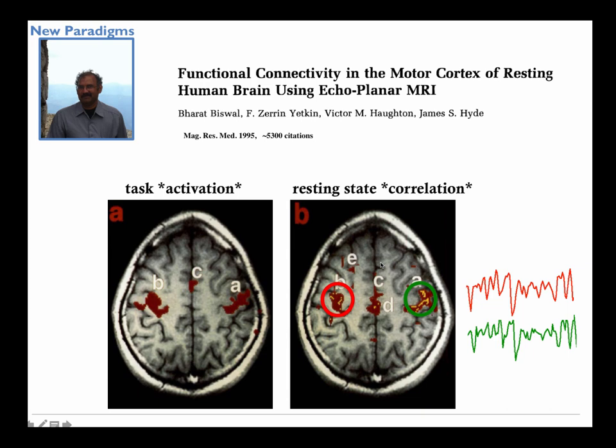What's interesting, though, is that back in 1995, when he did it, everyone was just starting their activation studies. And most scanners weren't this sensitive, and processing methods weren't really keeping up. Believe it or not, we didn't really have the ability in other packages to pick a voxel as a reference function. I know it's very easy in MATLAB or whatever now, but back then it was something odd. And so everyone ignored resting state fMRI for a decade. So nobody cared. There were maybe one or two papers trickling in over the years. It finally took off about 2005.